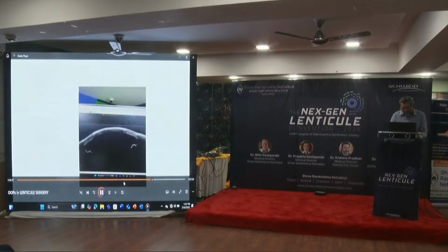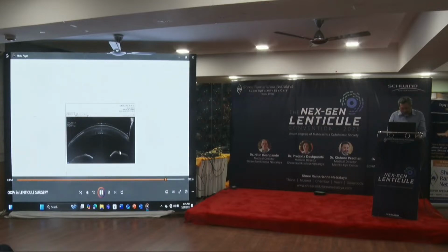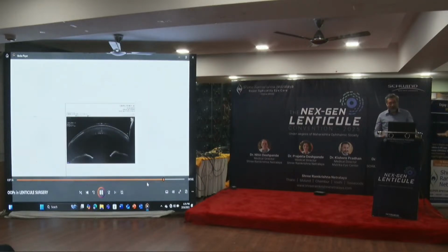If you look at the dynamic video of this OCT, the whole cornea was wide, but then the cornea was -8, about 6/12 now, with corneal scars. This is the VIP syndrome, as you say. This is one of the most important persons in Kathmandu, the Prime Minister's right-hand man's wife, owner of 22 companies. It took me one whole year to treat her.